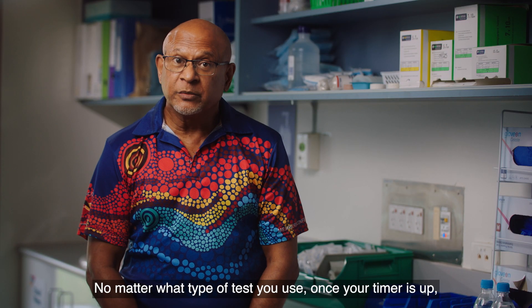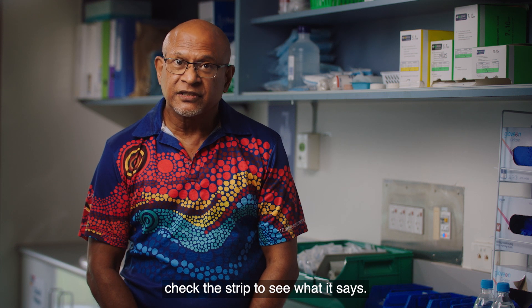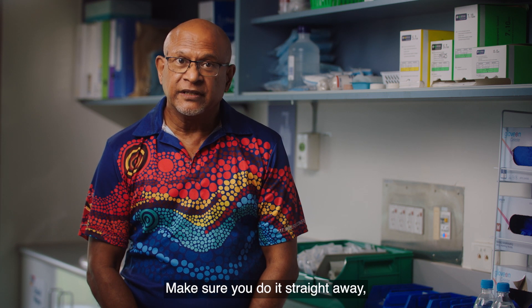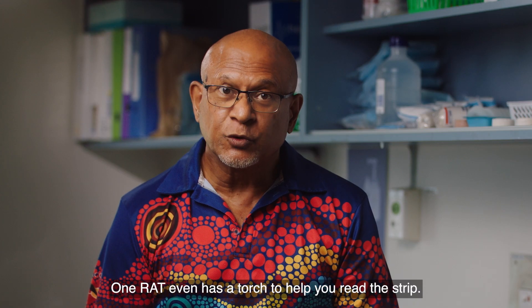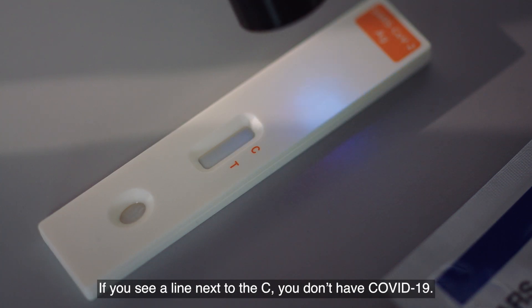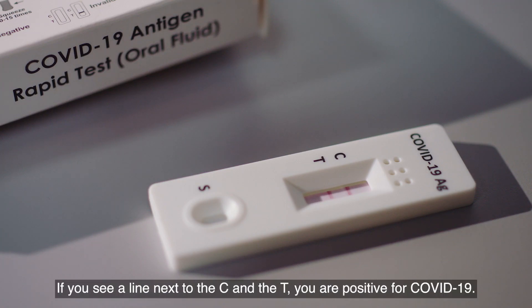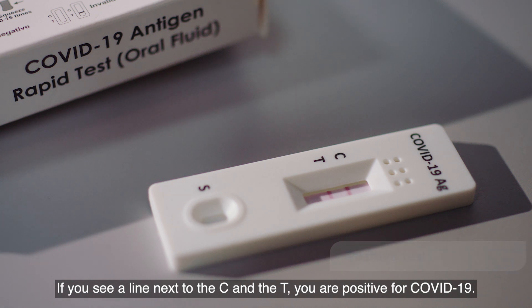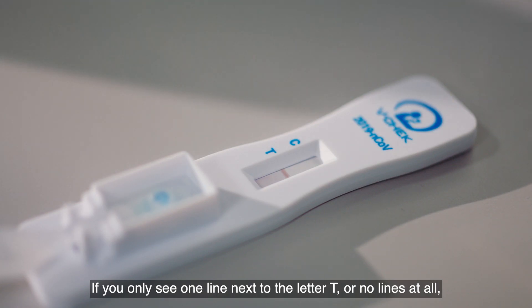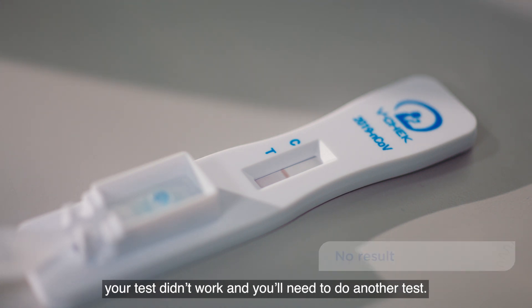No matter what type of test you use, once your timer is up, check the strip to see what it says. Make sure you do it straight away as it can be inaccurate if you leave it too long. One RAT even has a torch to help you read the strip. If you see a line next to the C, you don't have COVID-19. If you see a line next to the C and the T, you are positive for COVID-19. If you only see one line next to the letter T, or no lines at all, your test didn't work and you'll need to do another test.